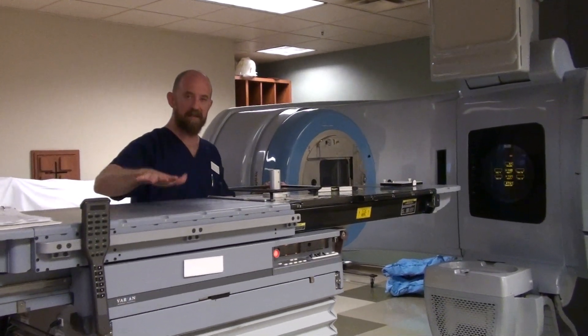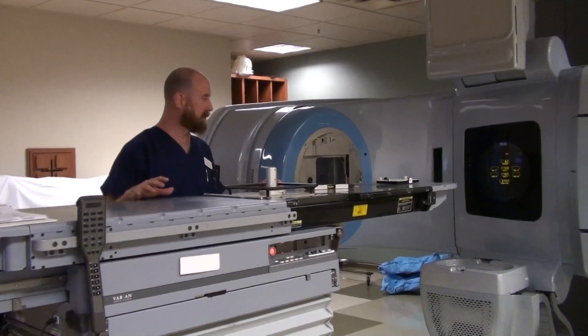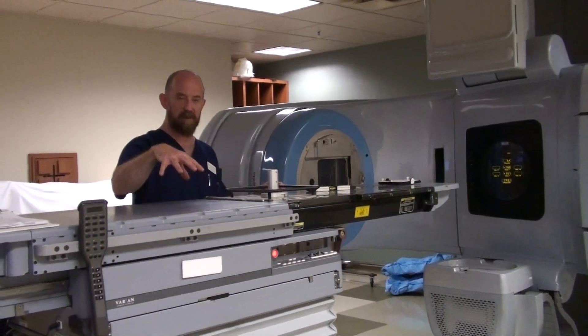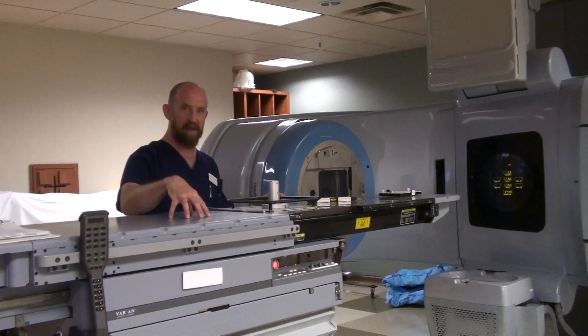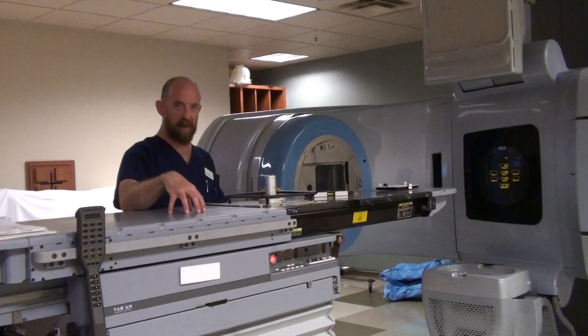It's going to check flatness, symmetry, all of those things that physics is really worried about, to make sure that the treatment is being delivered consistently within a certain amount of tolerance every day.